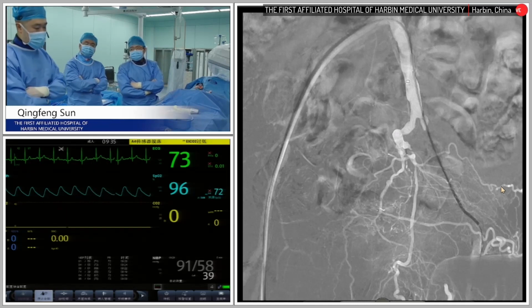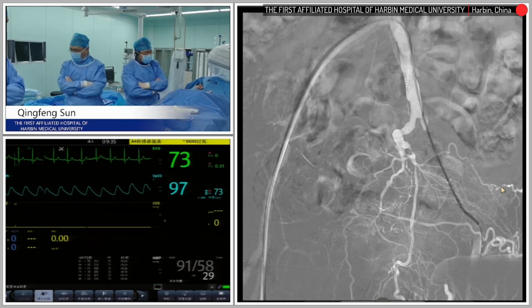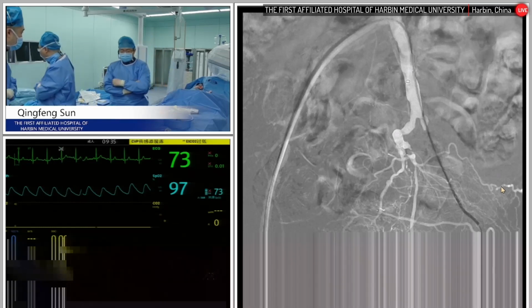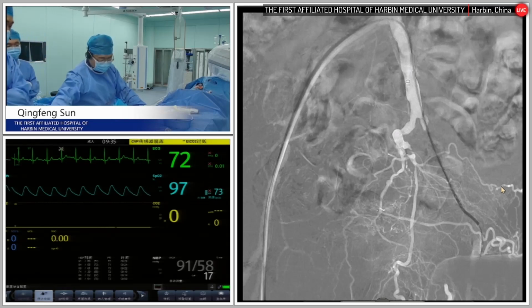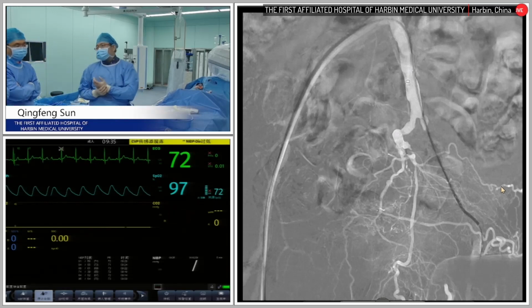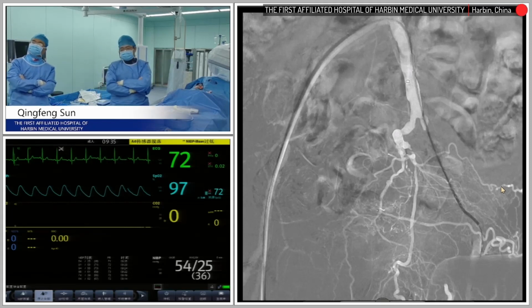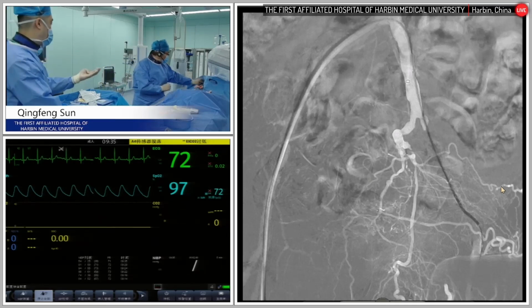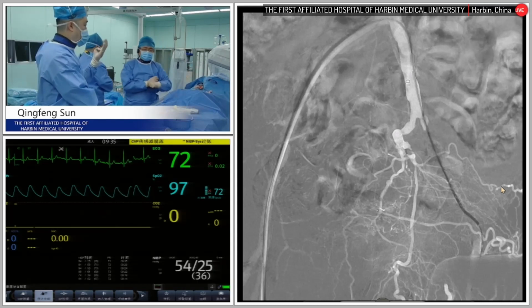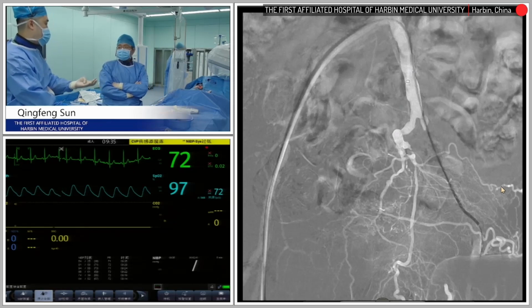Unfortunately, for our department right now, we only have CTA. And after using CTA for so many years, more than 10 years, for the pre-operation evaluation, we are actually good at it. So CTA is very important. You can see the different characteristics of the disease: calcification, the low density plaque, the other kinds of plaque or dissection, whatever. You can actually see everything.